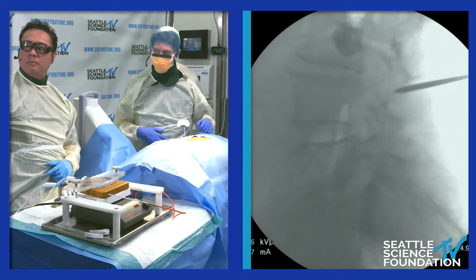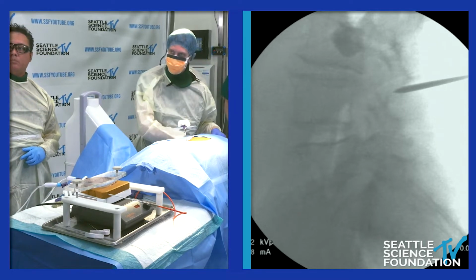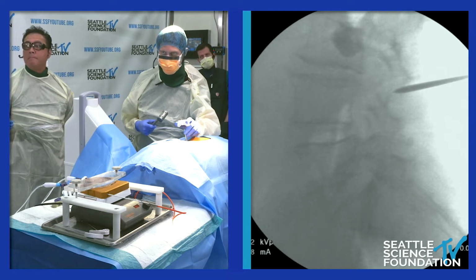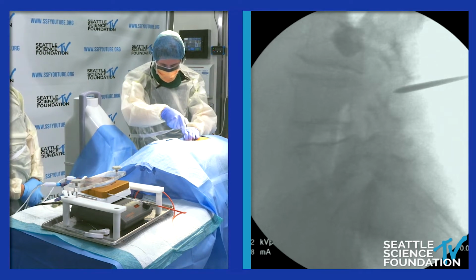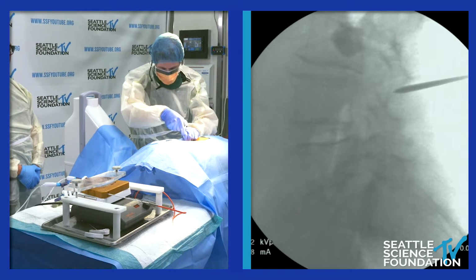Before crossing the medial line, we want to make sure we're about to enter the vertebral body. Right now we are fairly medial in terms of our approach. So we want to approach it a little more parallel, or more lateral, and maybe a little more outside of the pedicle in coming at it.